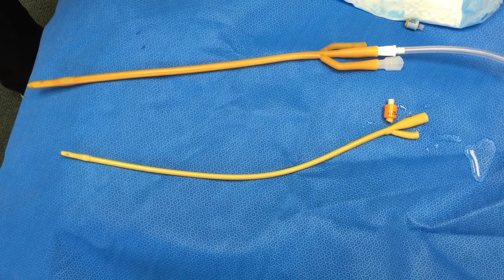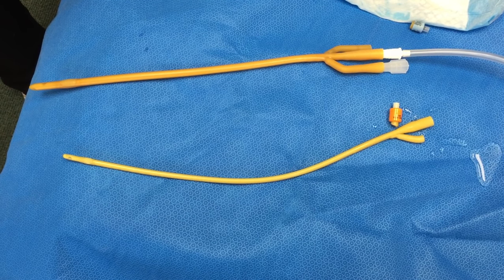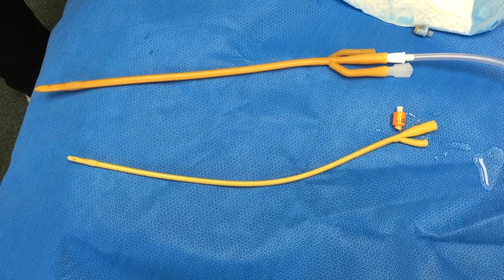Of course, if you encounter any difficulty or resistance, you should stop and let our office remove the catheter for you.